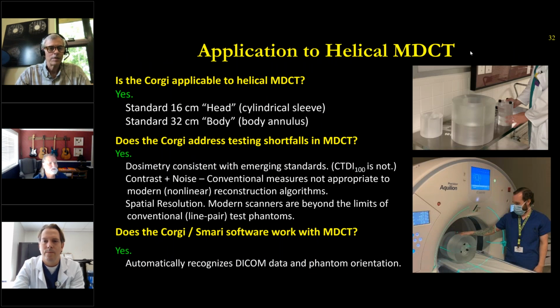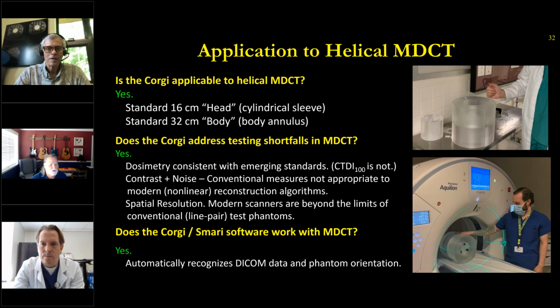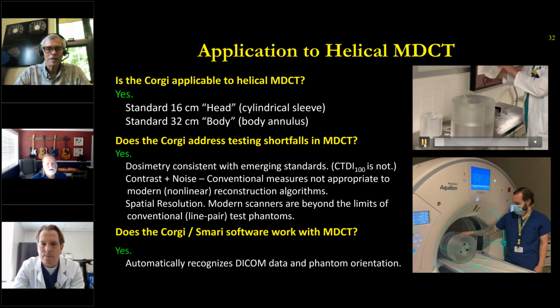Yes. Go ahead. Just to mention that the Corgi Phantom has applicability to helical CT. Jeff, do you want to play that movie? And so is it applicable to CT? Yes, it is. Does the Corgi address testing shortfalls in MDCT? Absolutely. The MTF is a classic.